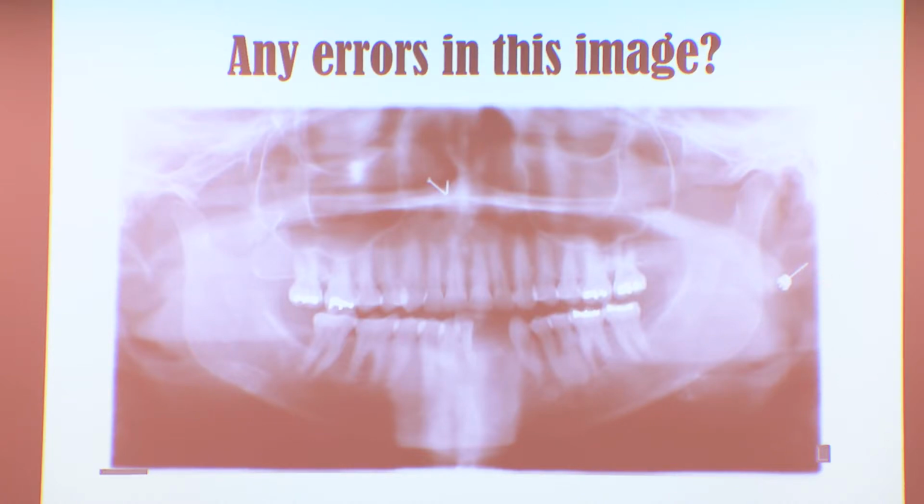Yep, an earring, nose piercing. If it's an easy one to take out, I'll have them take it out, but sometimes they can't get their nose rings out, and it's not really getting in too much of the dental anatomy. It'll show up in the sinus, but I just let them leave it in. Eyebrow piercings, that kind of stuff is fine. Can't really see too much else wrong with this.